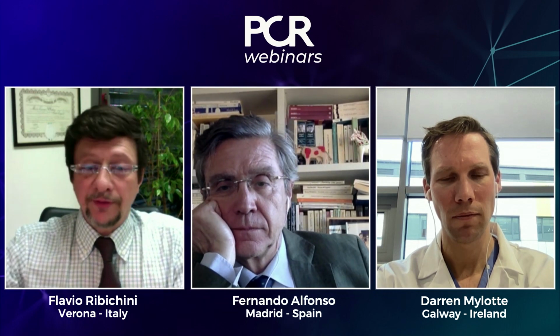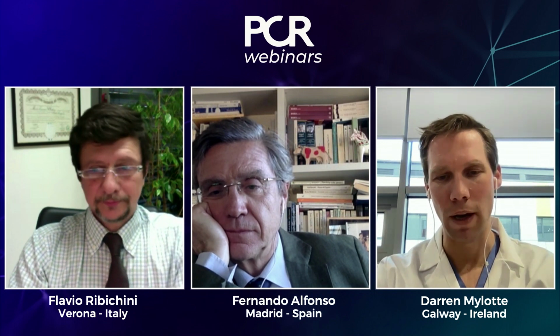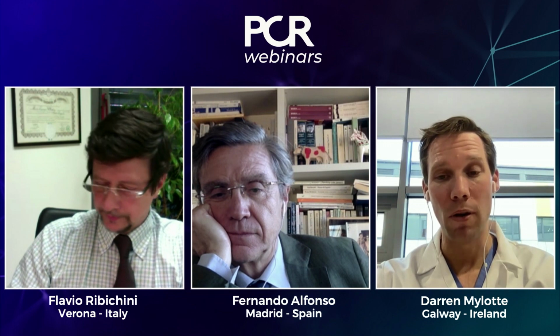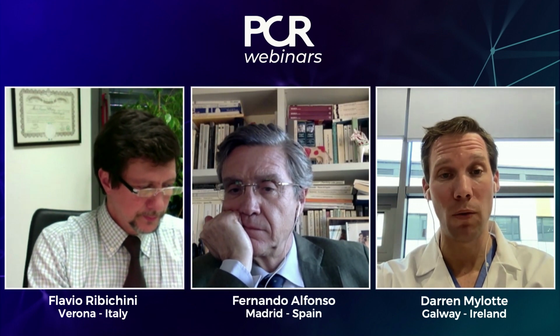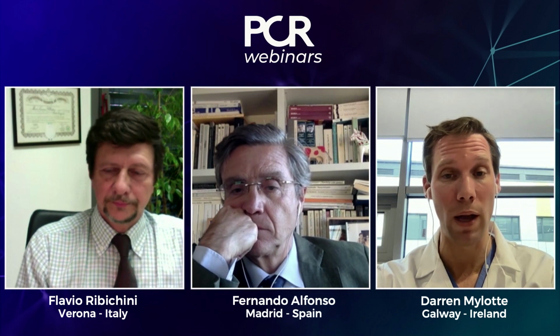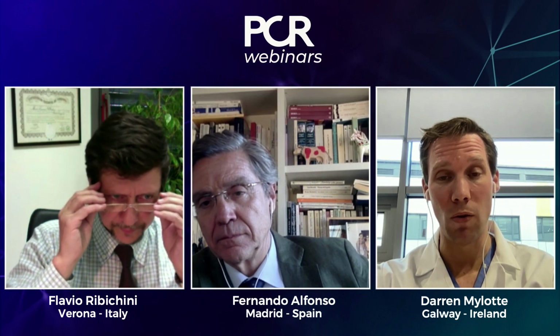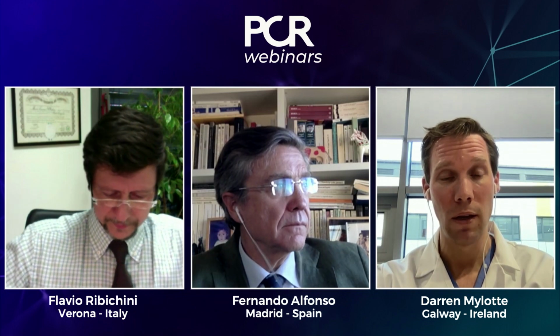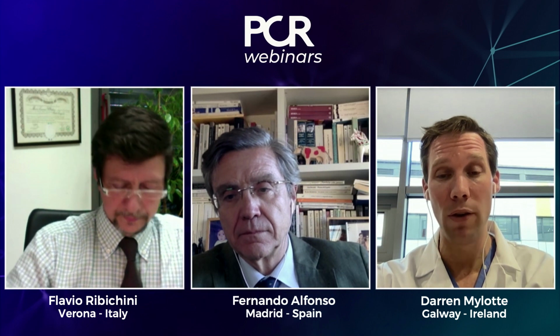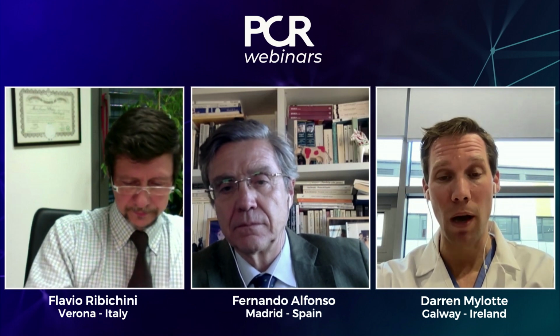Good. Darren, would you leave this result or you don't like it? No, I'm happy. The stented part looks great, as Fernando has suggested. And it's important to know that you don't get a stent-like result with a drug-eluting balloon. You get a balloon-like result. And if you don't have a dissection that is flow-limiting or extending well beyond the area in question, and you don't have residual stenosis greater than 30%, then I think you have to accept that result and know that in the coming months, you're going to get positive remodeling rather than the negative remodeling that you get with a stent. So yeah, I'm happy with this.